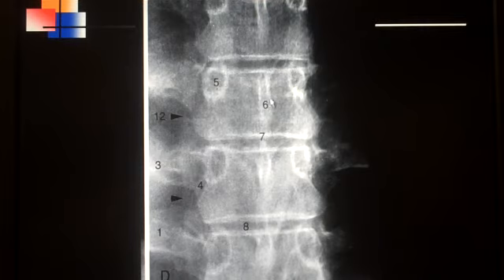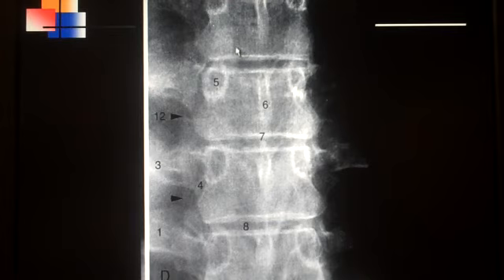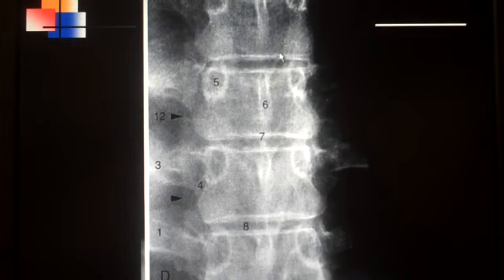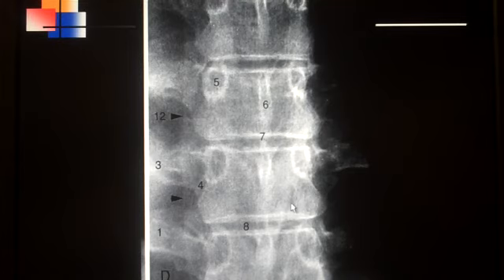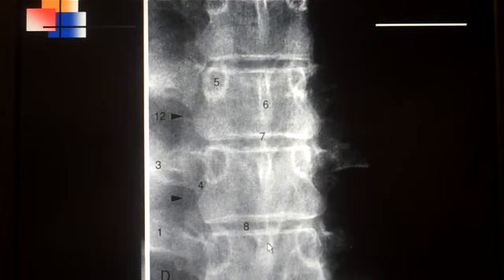Number six is the spinous process, and this spinous process belongs to this segment. You can just barely see the edge of the lamina right here and the edge of the lamina right there. Lamina in this area is very flat, so it's going to be not very distinguishable as far as being able to see the density of that. If I go down to this segment down here, you can see the edge of the lamina right along right there, coming down to this spinous that is right there.